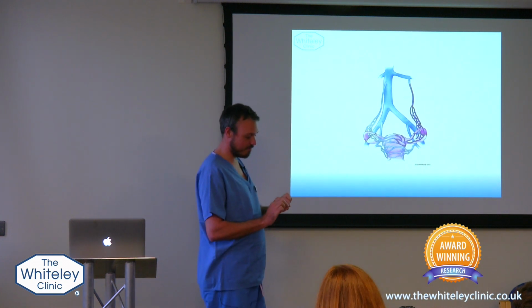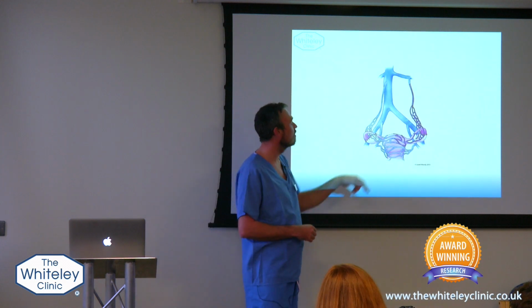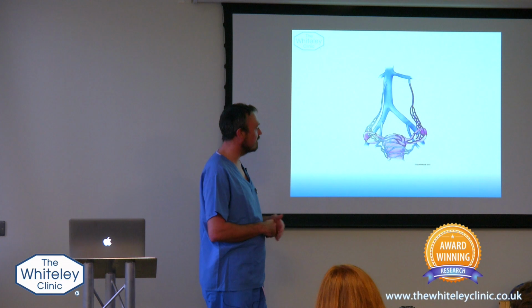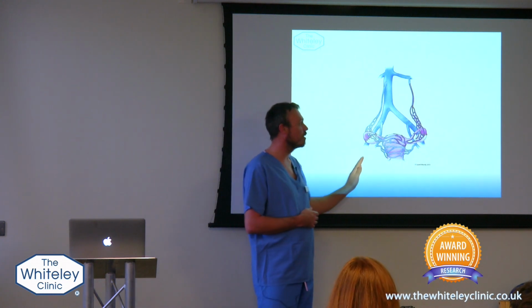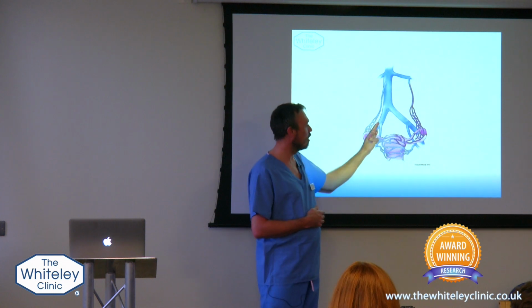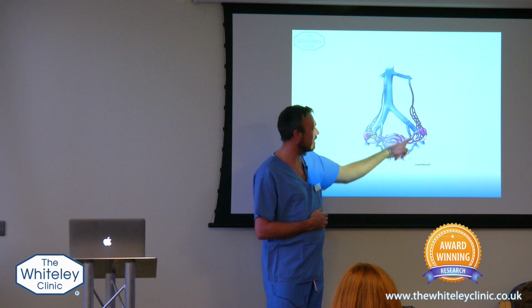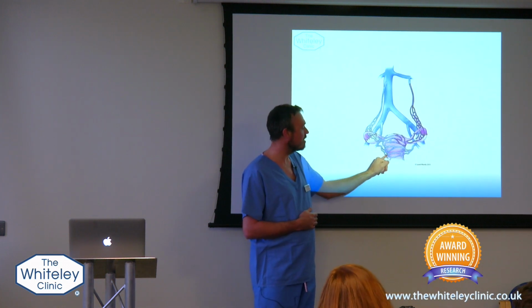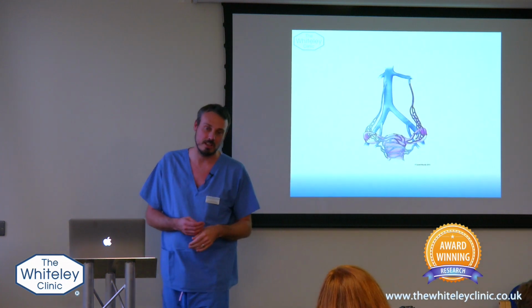So if I've got a very long, thin tube that I need to place into one of these veins, I need to do it in the most straightforward manner. If I go from the groin and go up, I've got to come up and back down on myself to get into this vein, and the same for this vein. And then once you get into these other smaller branches, you've got other curves to negotiate.